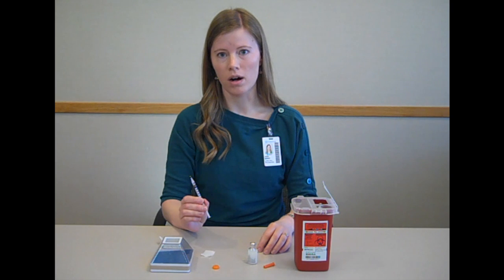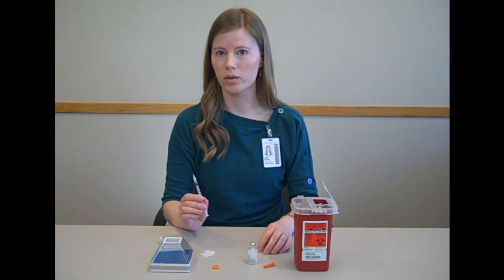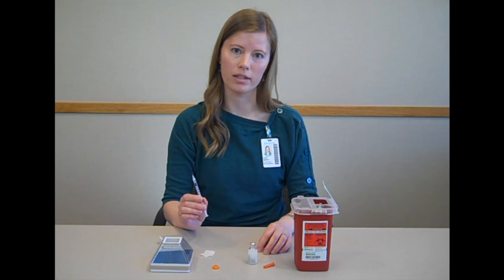Insulin can be injected into the upper arm, the abdomen, or the thigh. Make sure that you're rotating sites within the site, so that you're not injecting in exactly the same spot each time.